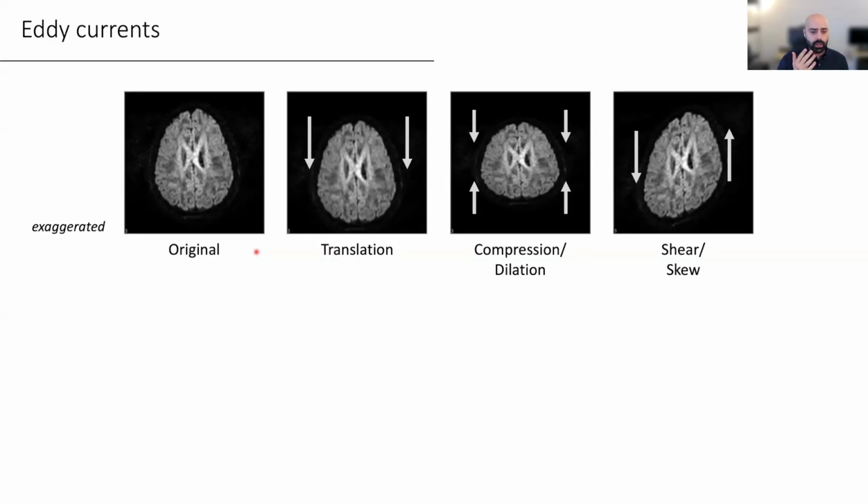And that's a rapid sequence of a gradient on, gradient off, gradient on, gradient off, and so on. And so when we do this repeatedly, these gradients, because they're magnetic gradients, are going to interact with some other components in the scanner that are metallic, and then they might produce secondary magnetic gradients that we didn't want to see in the acquisition. We didn't want them to be there, but they're there because of how the interaction works. And that just means that we have these unwanted additional gradients to deal with.